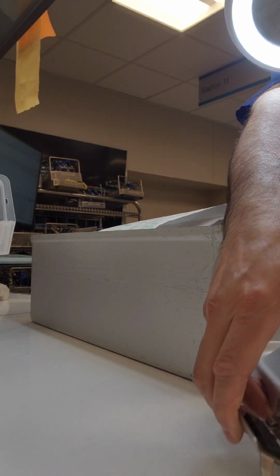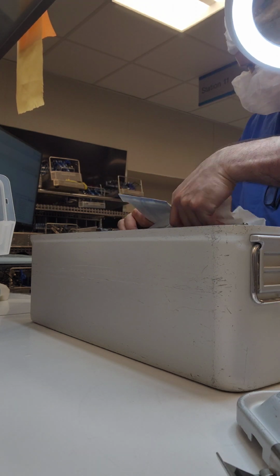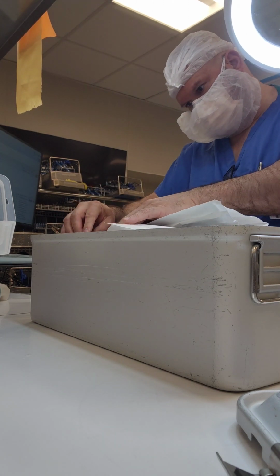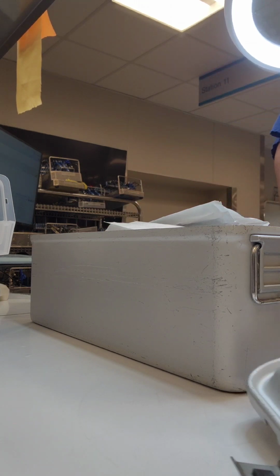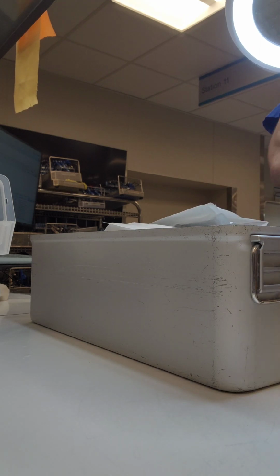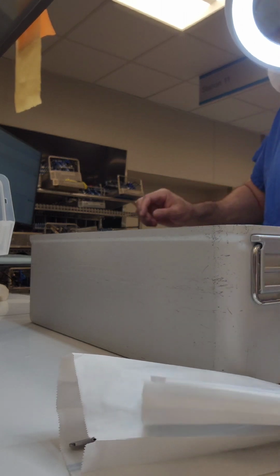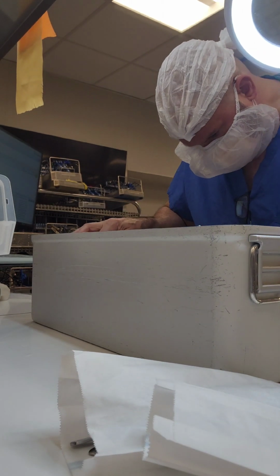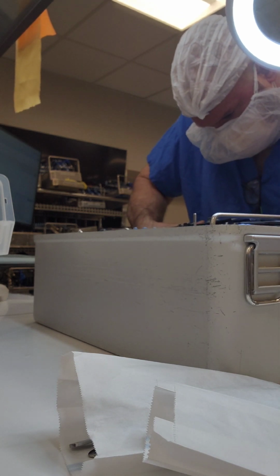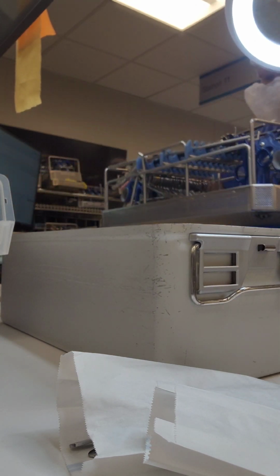Now, as I put the lid on, I didn't even have to press down. I noticed that it wasn't sitting correctly. So I tried to rearrange these craft style bags on here to see if it'll sit a little bit better, and a few forceps that were actually sitting on top. Again, I tried to put it on and it just didn't feel right. So I was thinking that the rack wasn't sitting correctly inside of the basket. So I'm checking for that, trying to push that rack down a little bit. But what I wind up doing is taking the whole instrument set out and just rearranging some stuff in there because it wasn't sitting right.